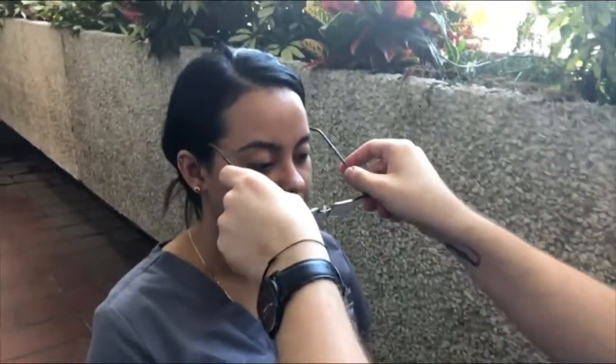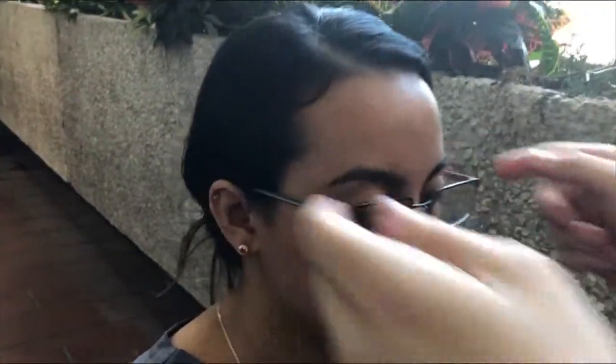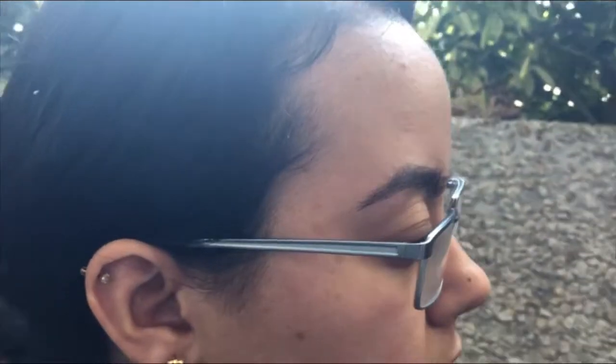I want to put the frame back on the patient. Then when you see from the side, you see that the panoscopic tilt has been reduced.